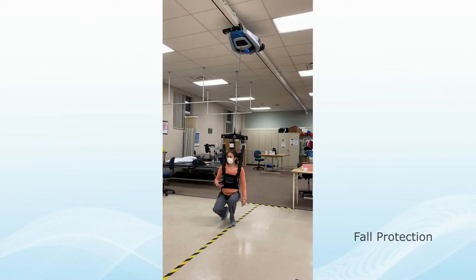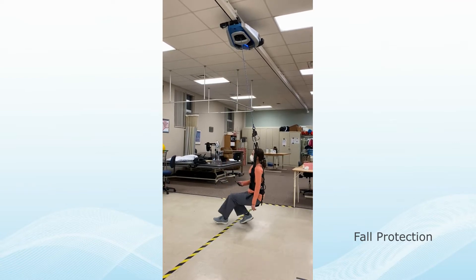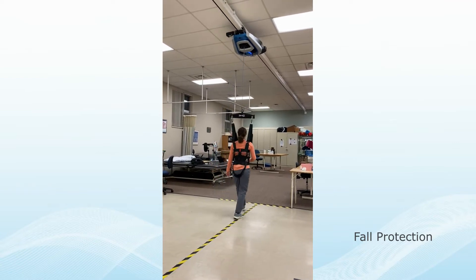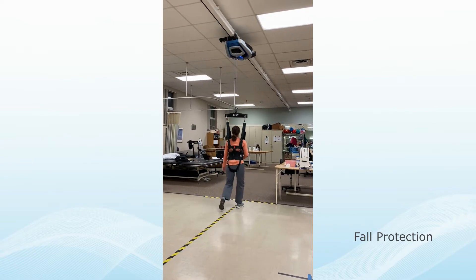An essential feature of Zero-G is fall protection. The fall protection can be adjusted to prevent a fall by a precise distance the subject moves downward, or by velocity, which is triggered by an unsafe speed of descent.